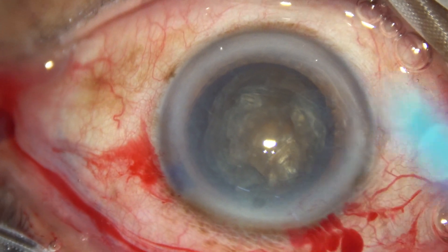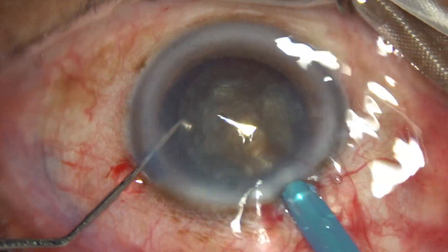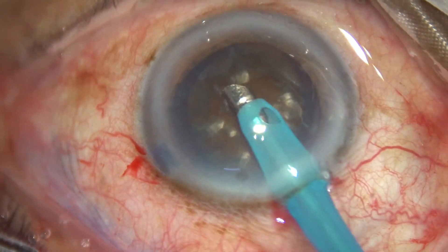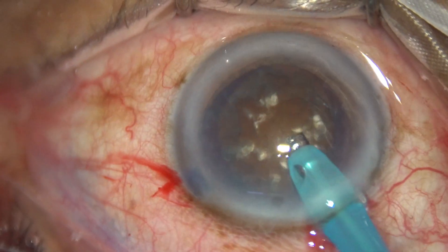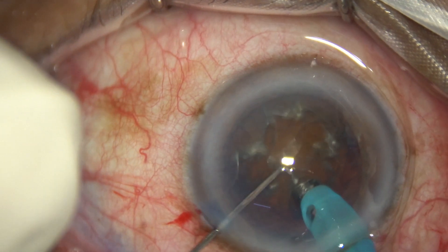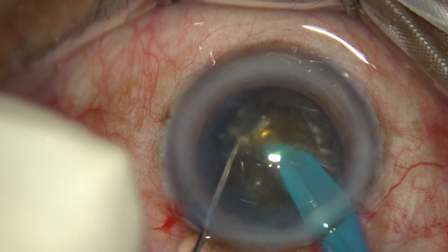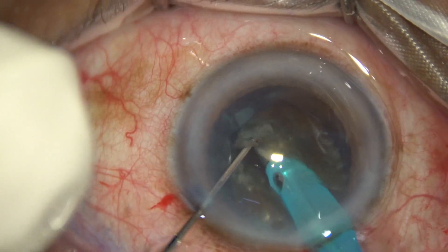The tip of the phaco probe has been exposed a little more for this hard cataract. Some superficial cortical lens matter is removed and now we perform submarine chop for this black cataract. I am using 90 to 95 percent ultrasonic energy in continuous mode. The chopper tip goes through the substance of the nucleus toward the posterior equator and cracks the nucleus as it goes.